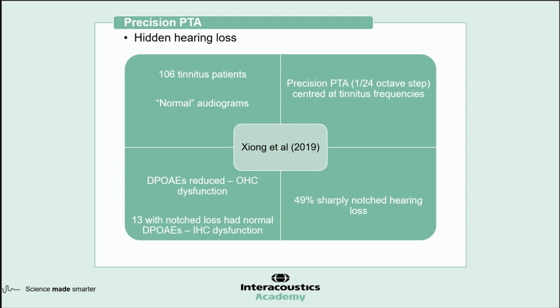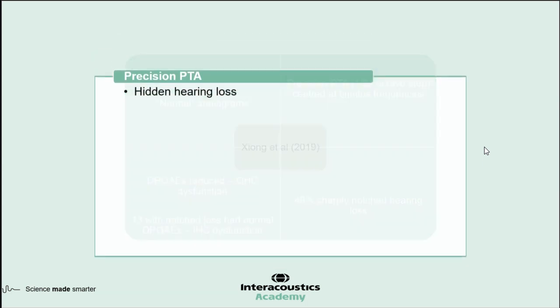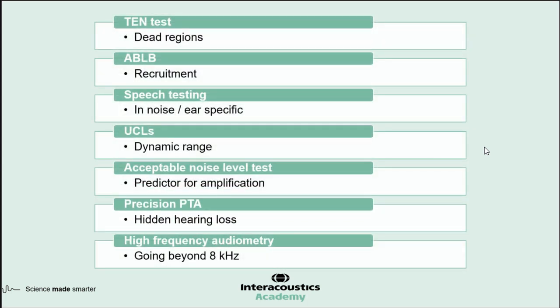I think this is quite interesting in terms of considering whether we are testing enough frequencies, either within the standard frequencies that we know, or also the high frequencies, which brings me on to my next one, which is high frequency audiometry.